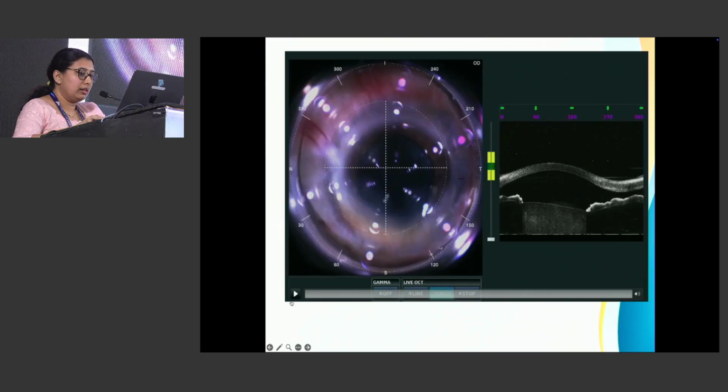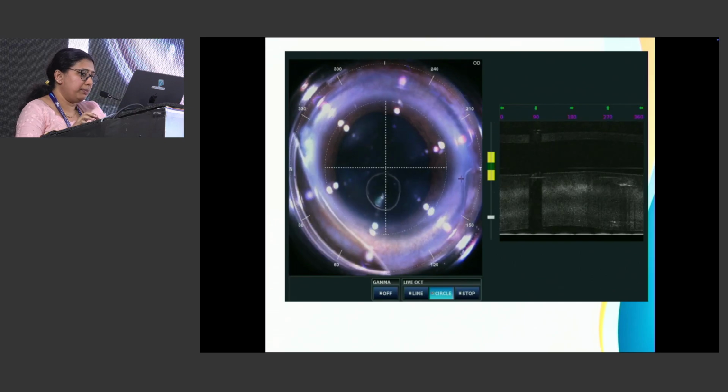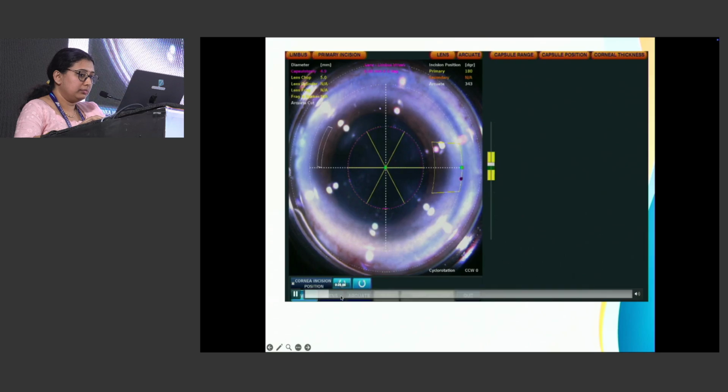Just finished with a fast video of an actual patient being operated with a LRCS. So this is when the suction happens, an air bubble is formed, and we have got a proper good docking. The real-time OCT is starting.